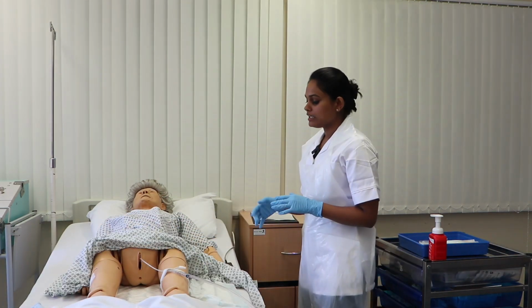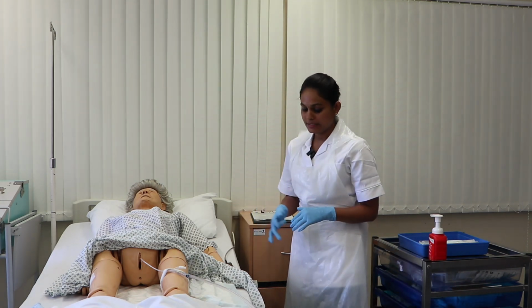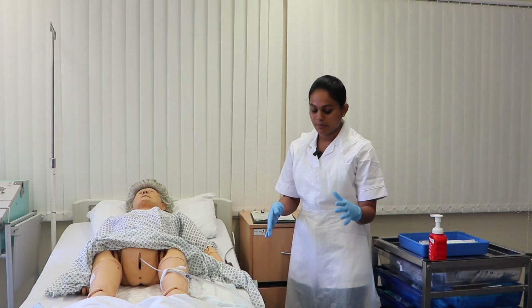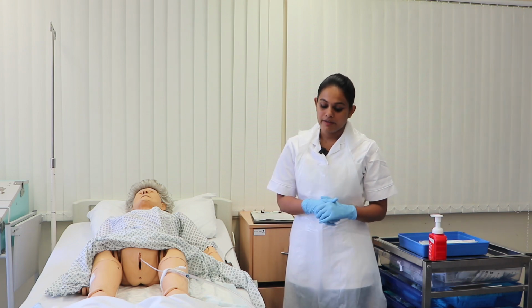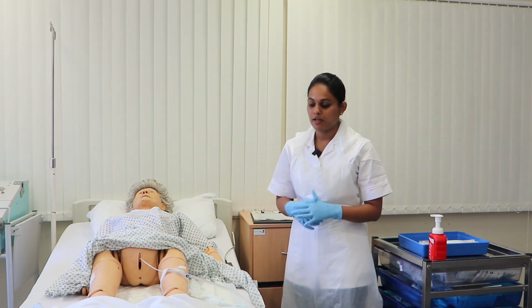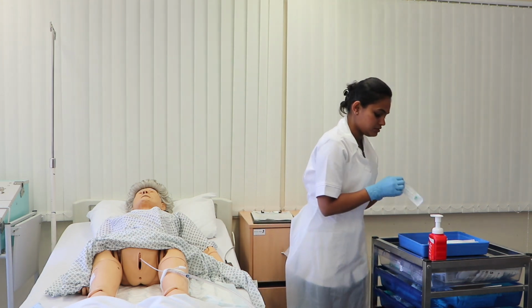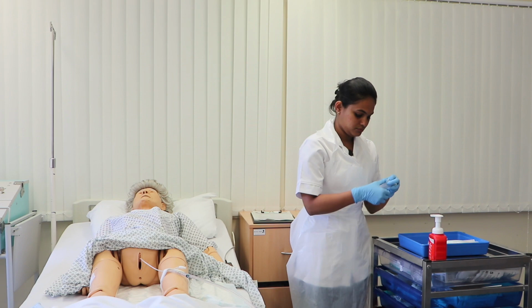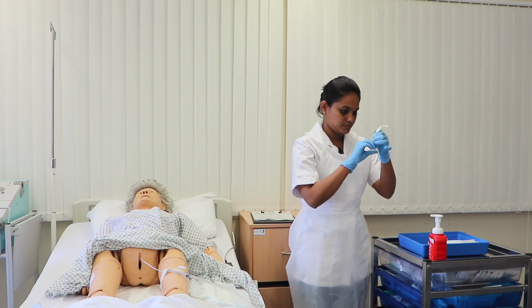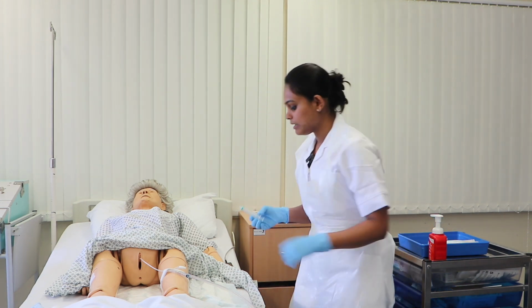In the real setting, I will clean the meatus and catheter using a saline soaked gauze, and also I will check the urine bag is placed below the bladder level and above the floor, and if the urine bag is filled, I will remove the urine, and also I will enter it in the fluid chart. And now I am going to check the functionality of the syringe. This wrapper will go to the domestic waste bin later, and I am going to deflate the balloon.